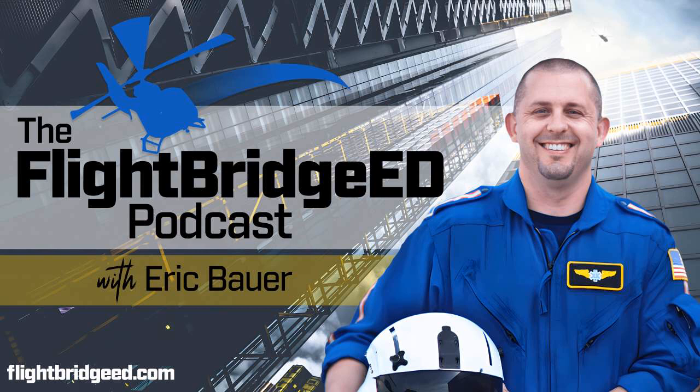So, how do we maintain a good FiO2 and a good PEEP so everything works together? Well, it's called the FiO2 PEEP slide. The way to start it out is you put your patient on 100% FiO2 and 5 of PEEP. Get them all set up on the ventilator, wait a few minutes, make sure you see an adequate saturation between 92 and 95%, and drop that FiO2 down to 50% right off the top.